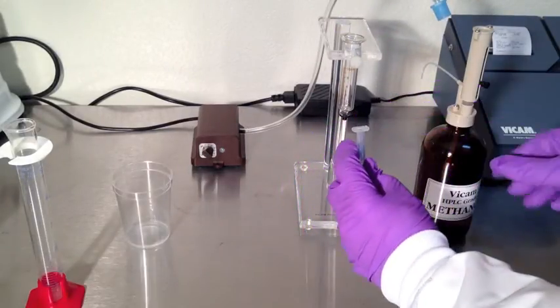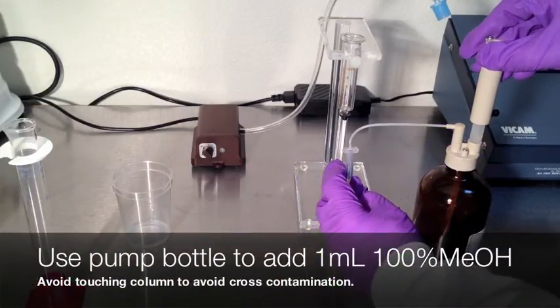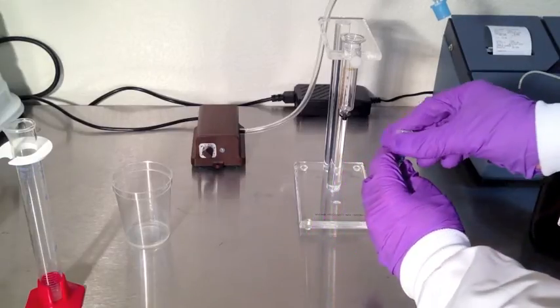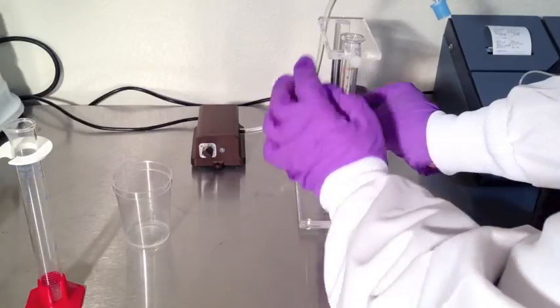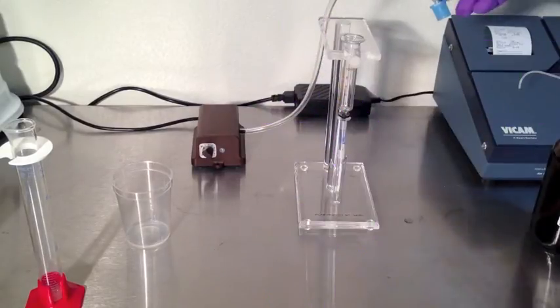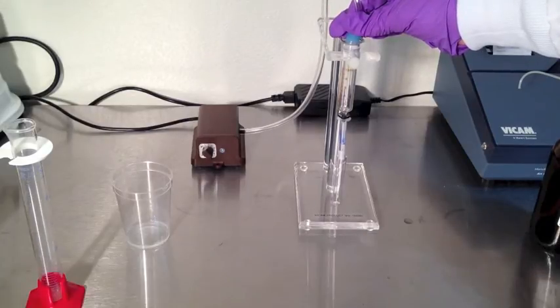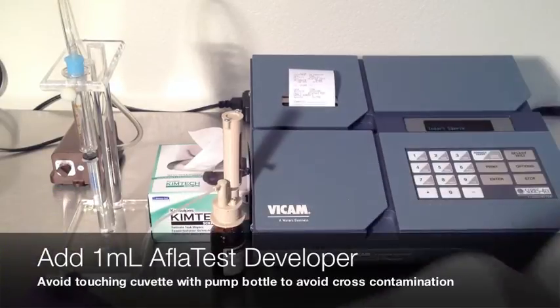Place a glass cuvette under the column. Use the methanol pump bottle to add one milliliter of pure methanol directly to the column head space. Attach back onto the pump stand. Add pressure carefully and pass one drop per second through the column. Remember, methanol is less dense than water and will pass through the column faster — use care for this step. Once air has passed through the column, remove the cuvette.